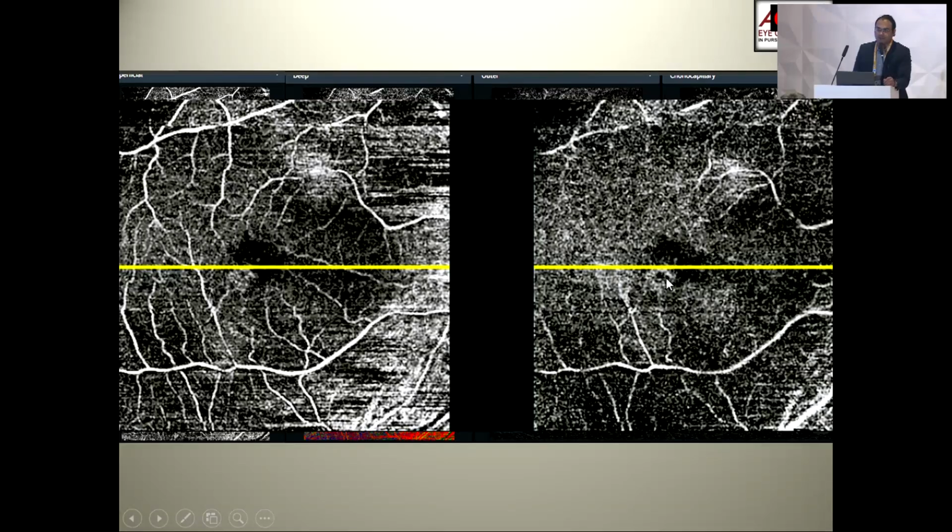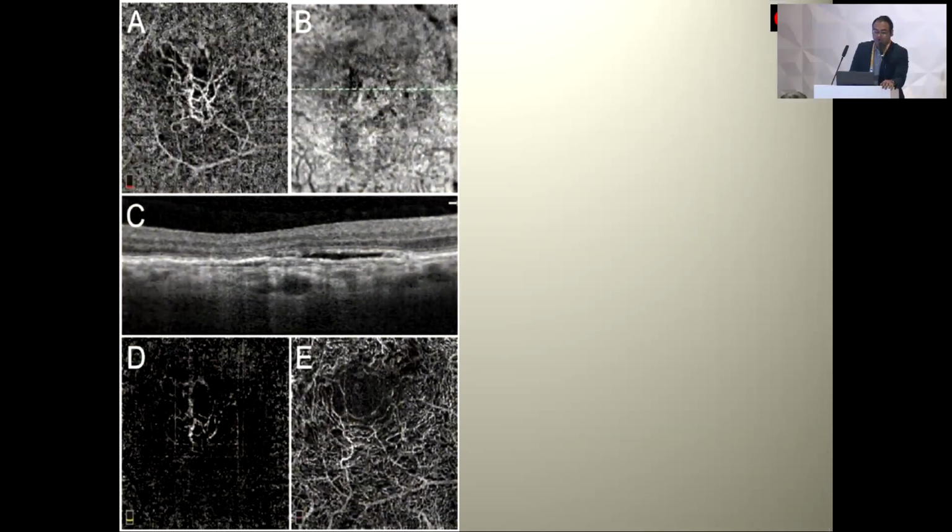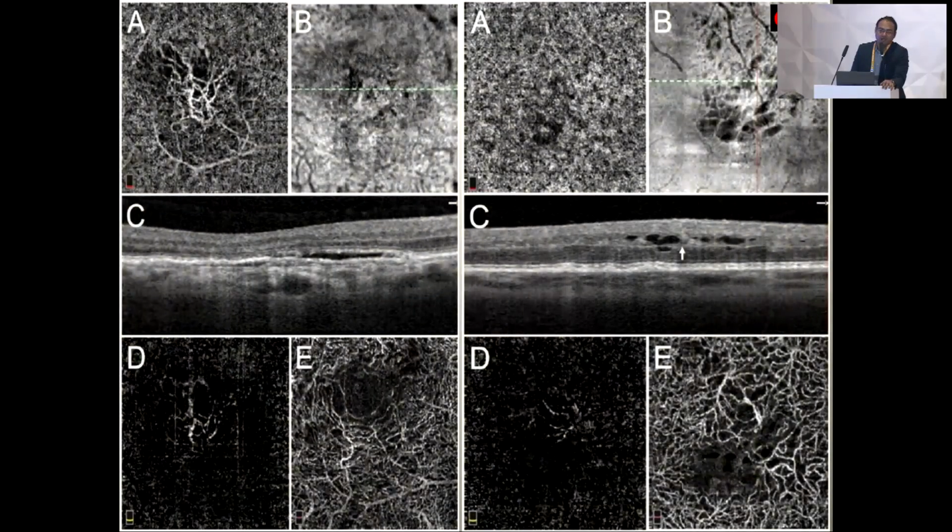Some new tissue is developing here, which is approaching the fovea very rapidly. So just for this sake, I would go for an injection in this patient. And again, you can show this. And after injection also, you can observe this thing. It is a beautiful modality to differentiate between type 1 and type 2 CNV.